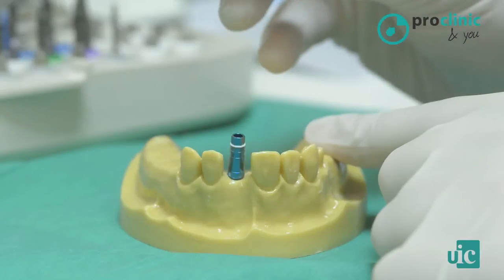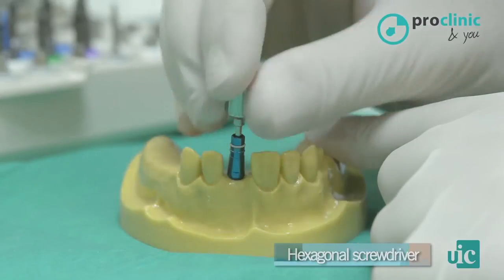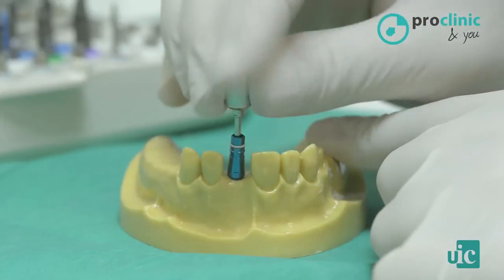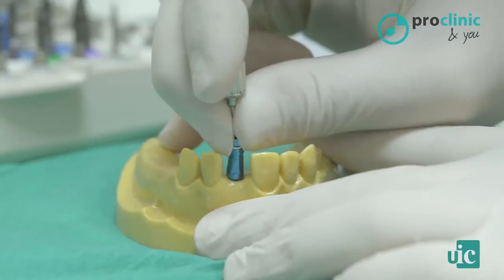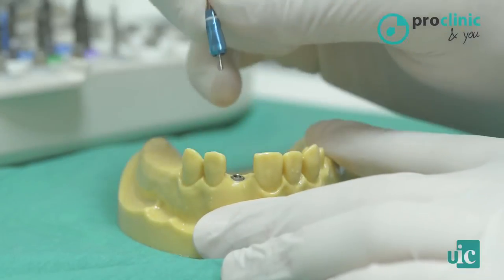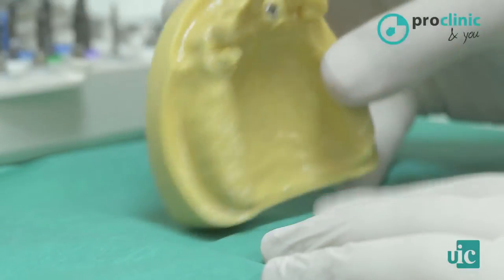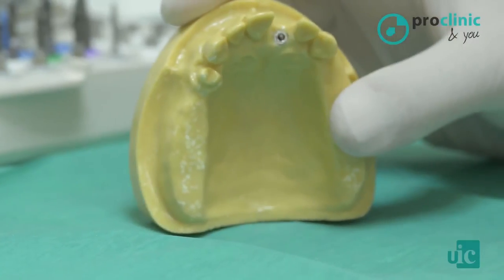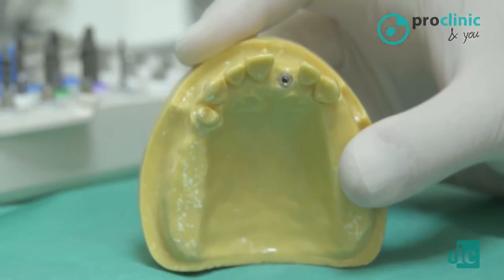With a hexagonal screwdriver, we remove the implant transporter. As you can see, the implant is placed correctly. The emergence profile is correct and keeps the minimum distances between teeth and keeps the minimal bone quantities.